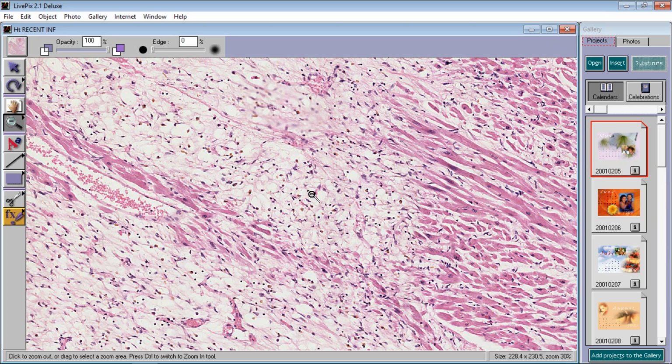And what happens if a myocardial wall ruptures? Well, then you get a pericardium that's going to be filled with blood. It could compress the heart, cause tamponade, and that's the most dangerous time for an infarct to rupture, about 5 to 7 days, which is still relatively acute.